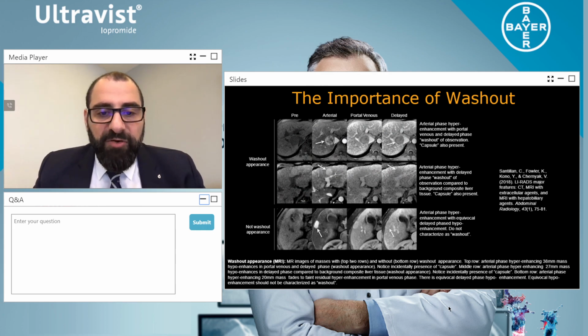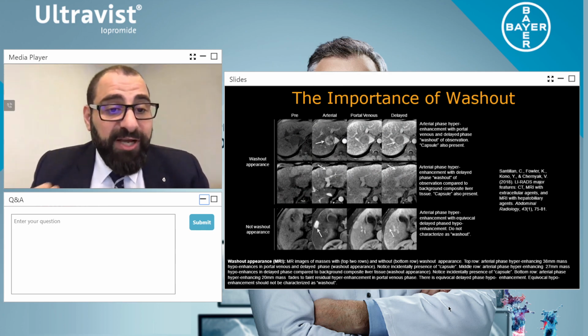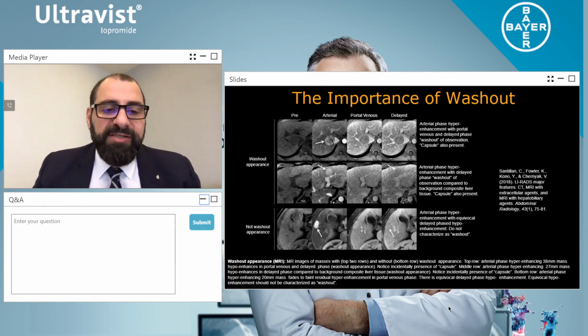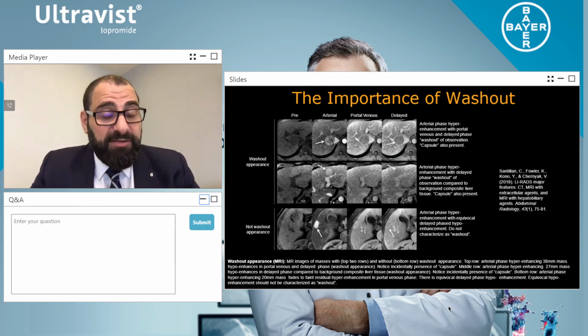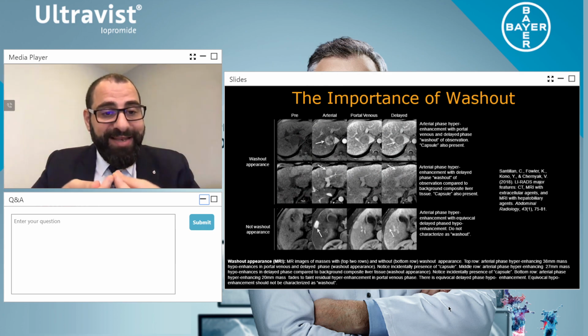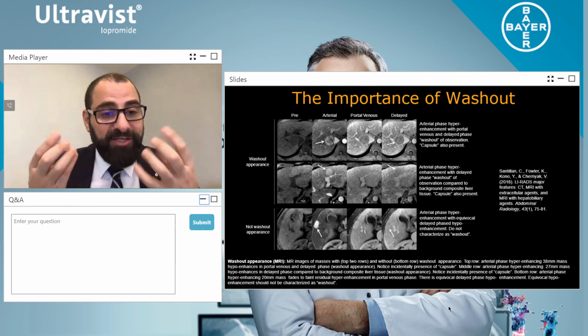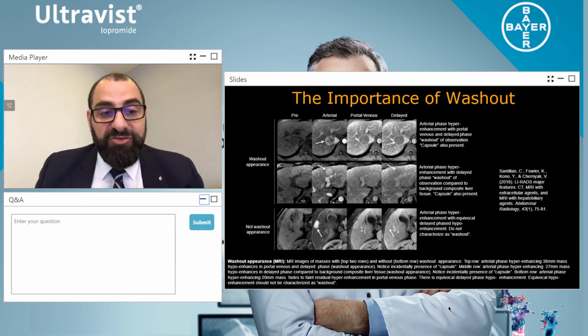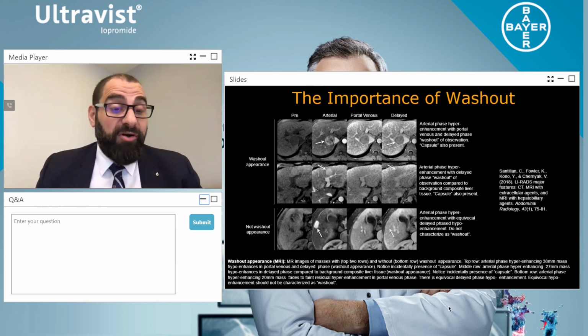And then if we look at also, sometimes you don't even get washout of lesions at all. So now we have to think about lesions. Does the lesion itself wash out? Or does the actual lesion border, the rim of the lesion, keep enhancing or not? And this is something that we don't really pay attention to when we're coming to look at protocol development and timing.